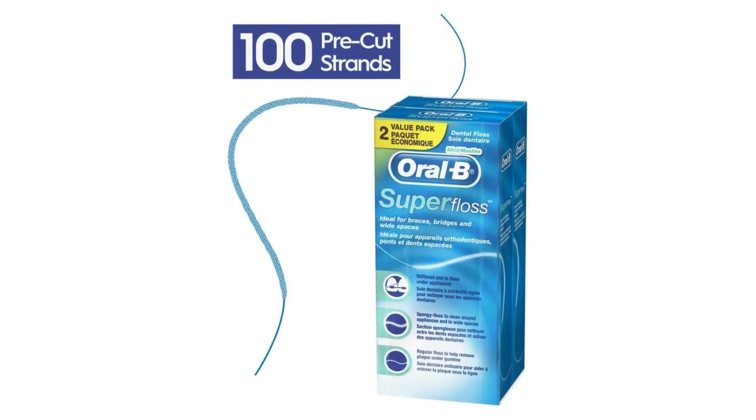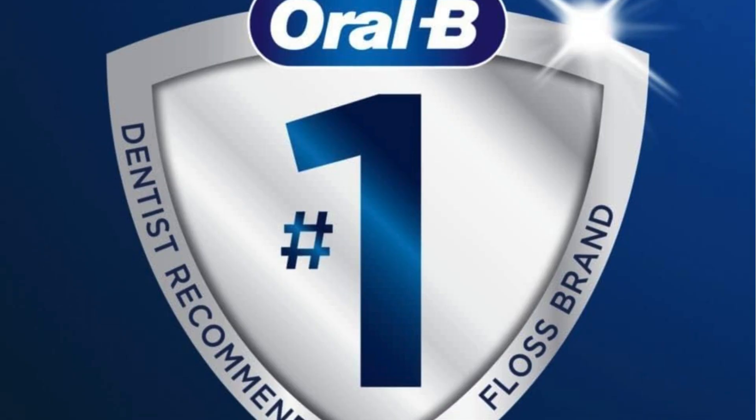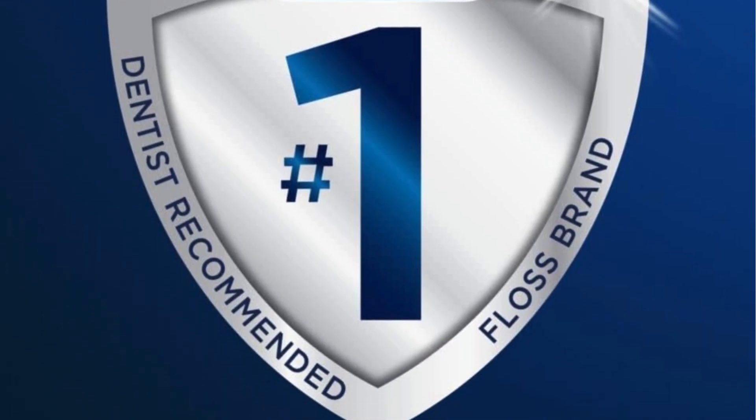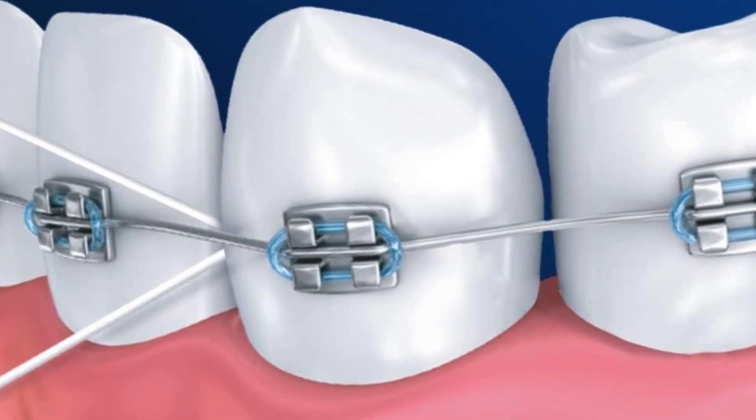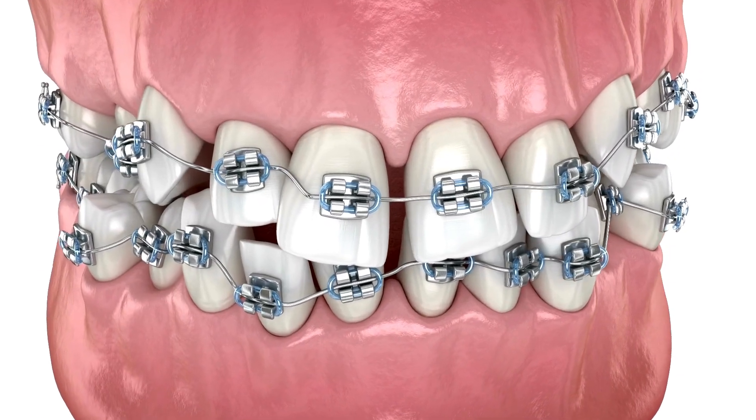First, let's get into the specifics. This product comes from Oral-B, a trusted name in dental care. It's not your average dental floss — it's specially designed for those with braces, bridges, and wide gaps.